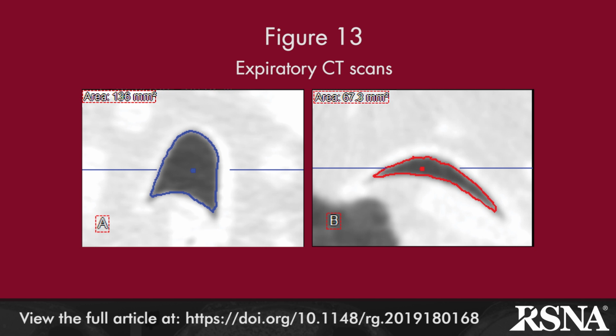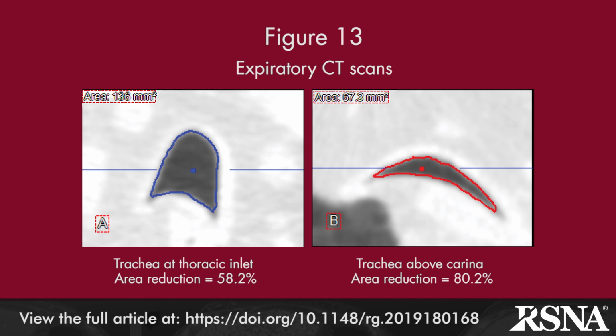Quantitative analysis of the tracheal luminal area from inspiratory to dynamic expiratory CT can aid in the diagnosis of tracheomalacia.